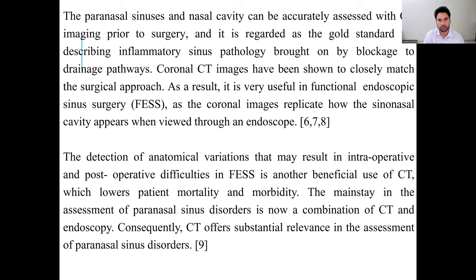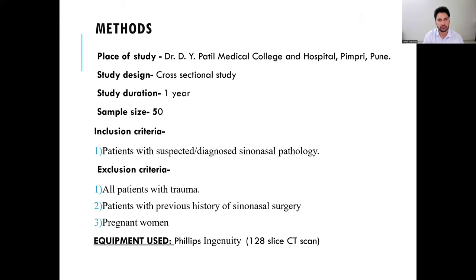Coronal CT images closely match the surgical approach and are very useful in functional endoscopic sinus surgery, as coronal images replicate how the sinus cavity appears when viewed through the endoscope. The detection of anatomical variations that may result in intra-operative and post-operative difficulty in FESS is another beneficial use of CT, which helps lower patient mortality and morbidity. The mainstay in the assessment of paranasal sinus disorders is now a combination of CT and endoscopy, and CT offers substantial relevance in this assessment.